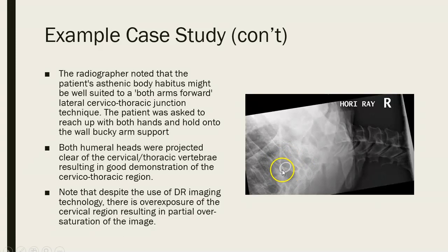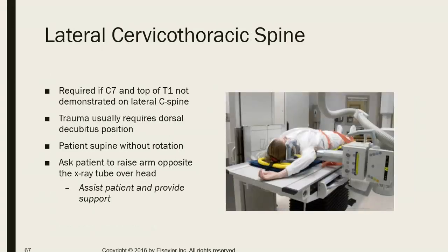They usually show up whenever a patient has one of those camisoles on with the plastic rings or a bra, which, if they were in a true trauma situation, you wouldn't be able to remove anyway, so you just put a note in the chart about that.